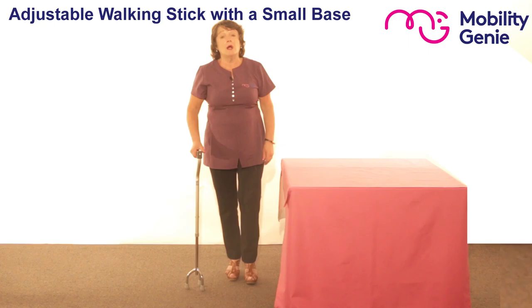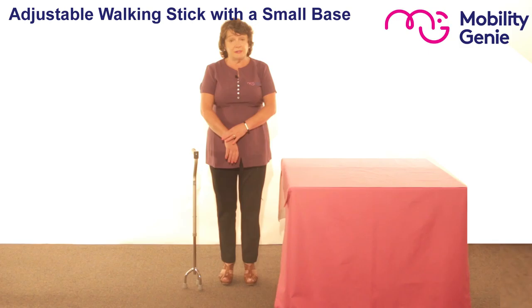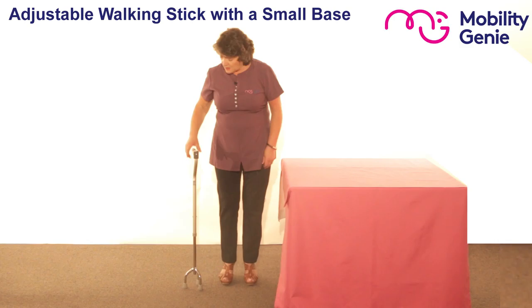With my hands down by my side you measure the person to the wrist bone — that's the knobbly bit of the wrist bone. So you can see that it's adjusted perfectly for me.